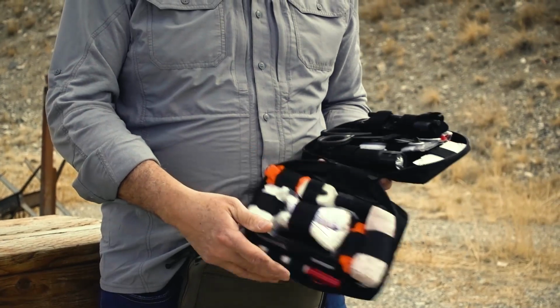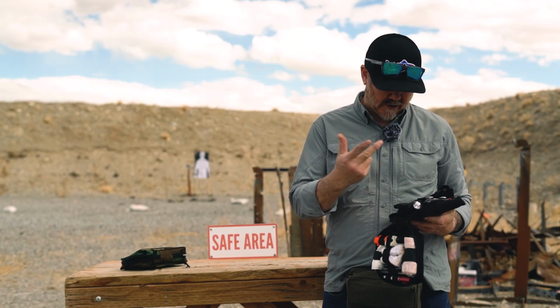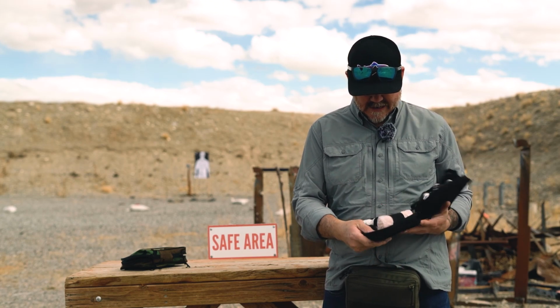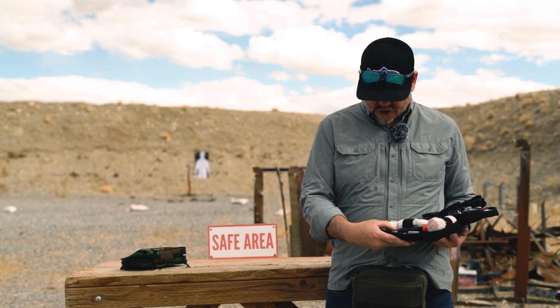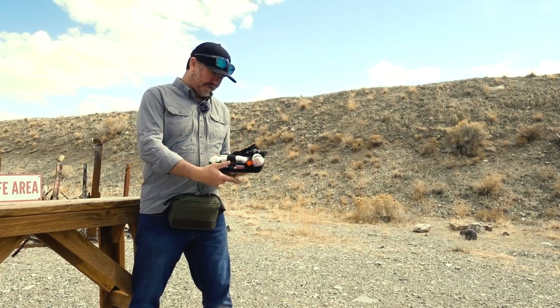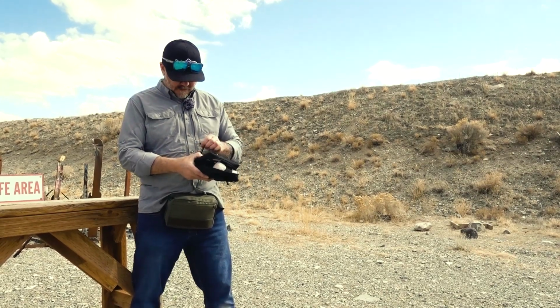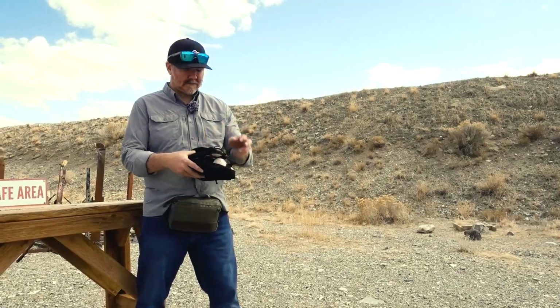What's cool about the one wrap is, as I mentioned, everything is configurable. I've got shears, tweezers, a tourniquet, chest seals, some band-aids, a small flashlight, a large flashlight, decompression, 2 different markers, Sharpies, 2 sets of gloves, and then I also staged gloves up front. On the one in my vehicle, I'll stage gloves in the pouch up front here as well.